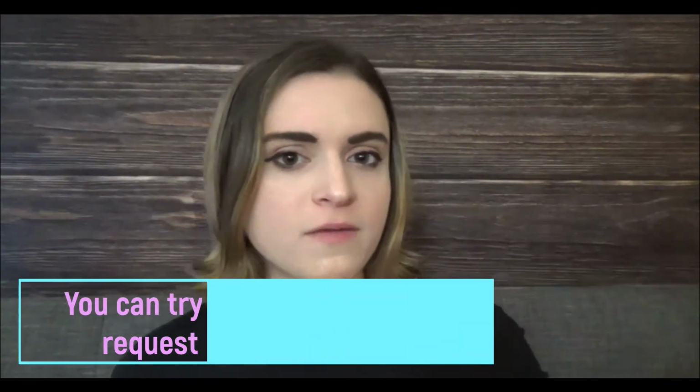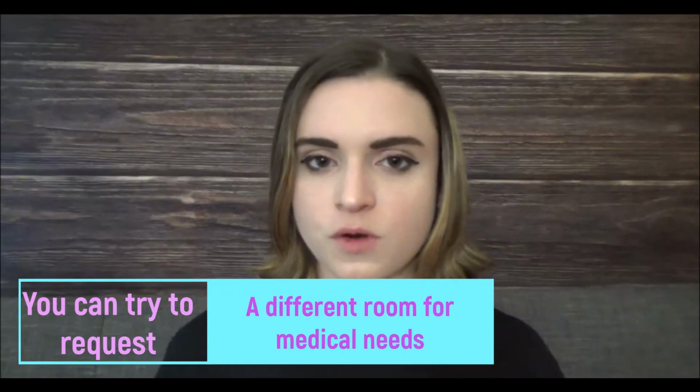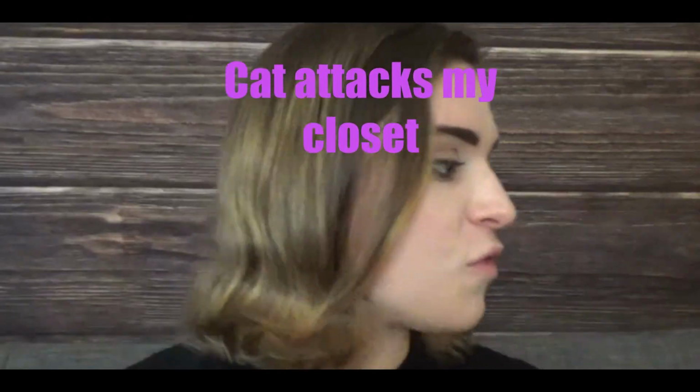Because staying in a hotel room, out of your normal space, new bathroom, new setup, it can be a little bit much. And I would recommend, first thing, take a good minute to look around the room, make sure you have a good bathroom that you like, make sure that you have space for all of your supplies. Bring all of your supplies with you and try to also bring some extra supplies like what I mentioned with bringing a portable ostomy bag that has all of the things you need to make quick dressing changes for any wounds you may have or your ostomy. Try to make sure that you have everything that you need in your carry-on to make quick dressing or ostomy changes.